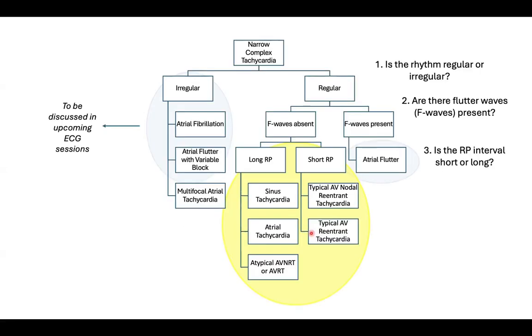Yeah, just go back one second. Only that yellow, so everything you highlight in yellow, these are very regular, and you're going to go through the pathophysiology of these, but the reason why they're so regular is they have a very clear fixed circuit, and all of them have a clear circuit that's driving this for the most part. And so they're really regular. The only time where you may run into some issues is if something is very, very fast, like greater than 160 beats a minute. Sometimes it's hard to differentiate regularity from irregularity. But yes, most of these have a very regular fixed circuit.